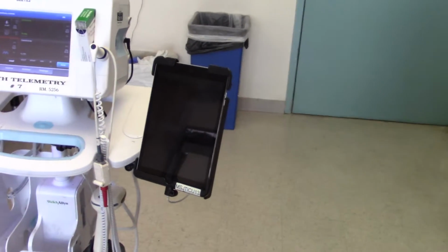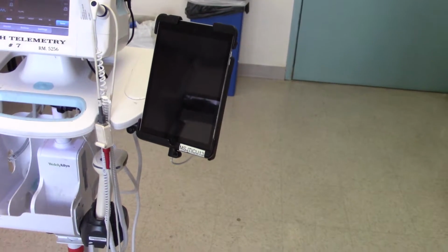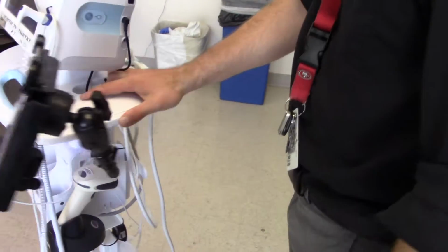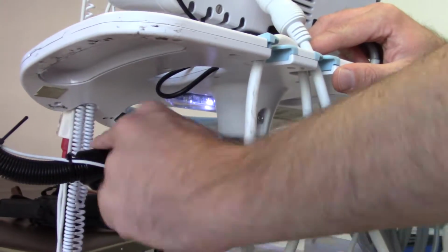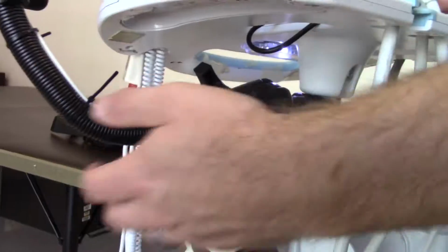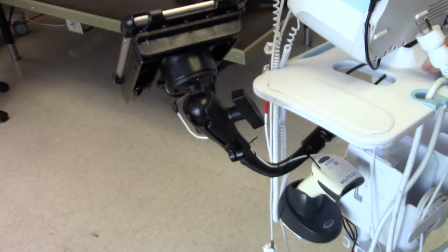Okay, so that covers the armature, the two shoulder joints, the aluminum flexi pipe in between them, the locking frame. Everything comes from Ram Mount. Okay. And the biggest problem with these is these arms get broken. That's correct. So typically, where we see failure is down in this area, and the mounts get separated and break off. The other issue that's a constant issue is that they lose tension with the ball joint. And so you walk around the floor and you see a lot of them sitting down like that and flopping all over the place, because they get hit and eventually the ball joint loosens or starts to wear out.